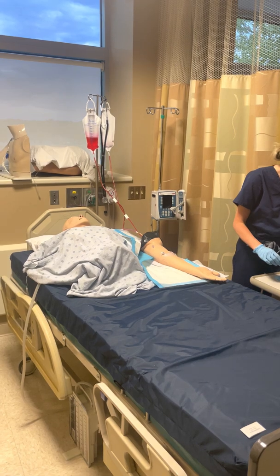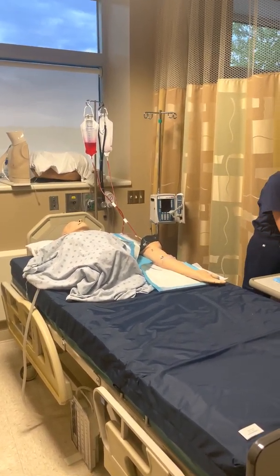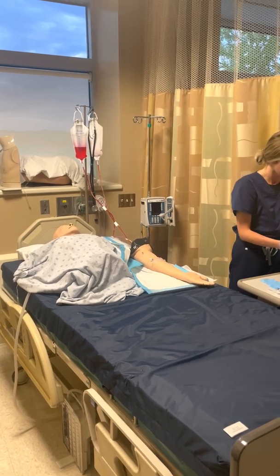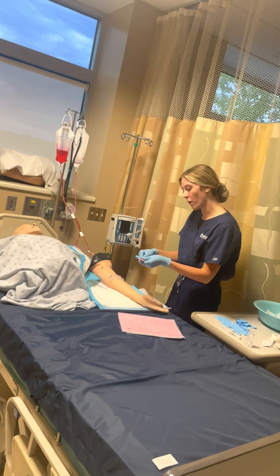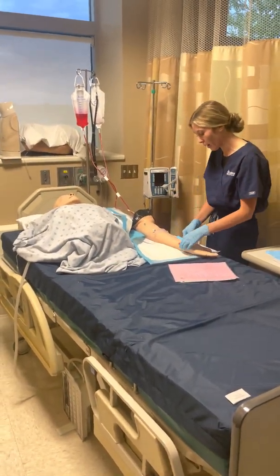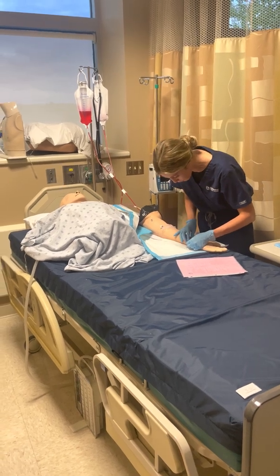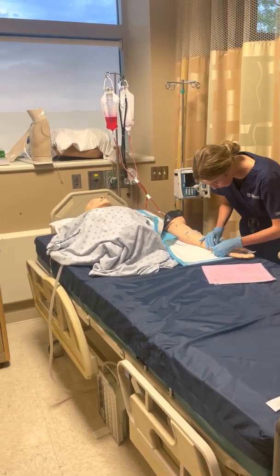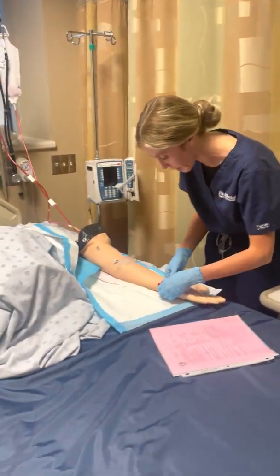All right, so now that we have the consent form signed and we're getting closer to getting things started here, I'm going to have another nurse come in, and he's just going to confirm the blood and bring in the blood. There is just one armband that I have to put on. I know you have your hospital wristband already, but this one is specific to the blood transfusion process, okay? Okay. So I'm going to put this on, and then it looks like Nurse Sam is just about to walk in with your blood here.